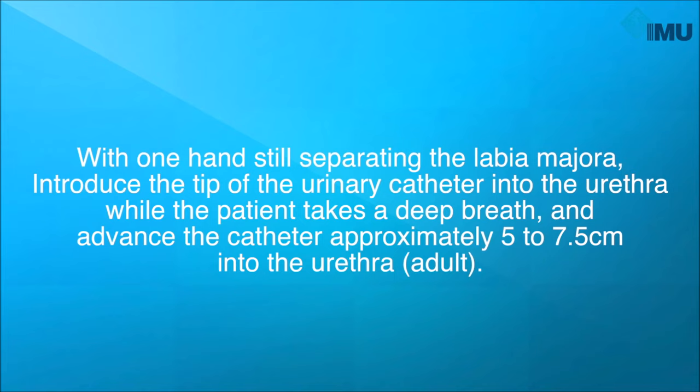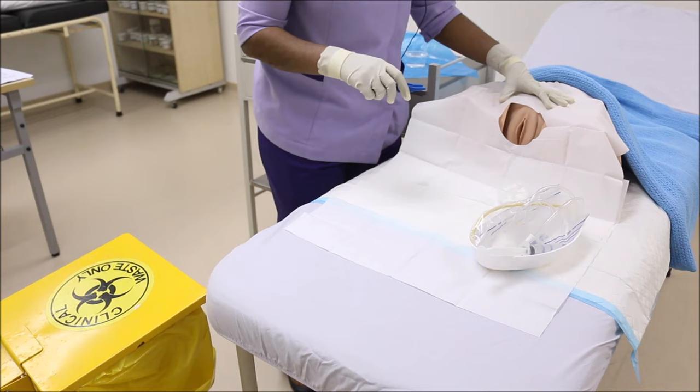Insert the tip of the urinary catheter into the urethra while the patient takes a deep breath, and advance the catheter approximately 5 to 7.5 cm into the urethra. Mrs. Jane, please take a deep breath as I insert the catheter. You may relax now and take easy breaths.